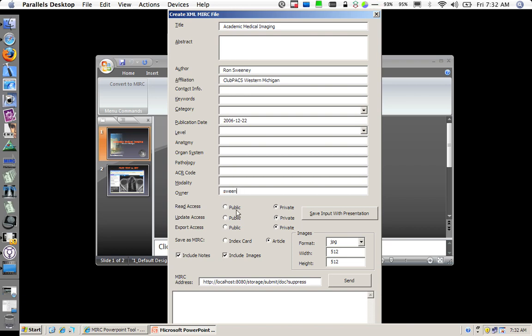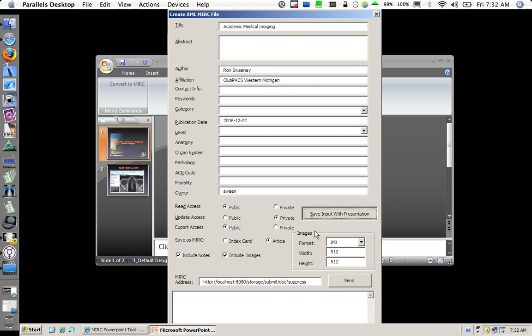The next block here is I want to set up some permissions to it. I want everybody to be able to read it. I do have published rights on the MIRC storage service that I am sending to. I am the only one who wants to update it. And I want anybody to be able to export it. I am going to save the input above with the presentation.